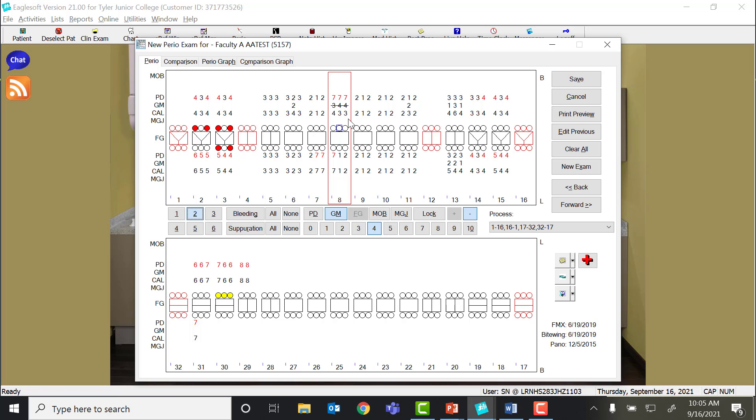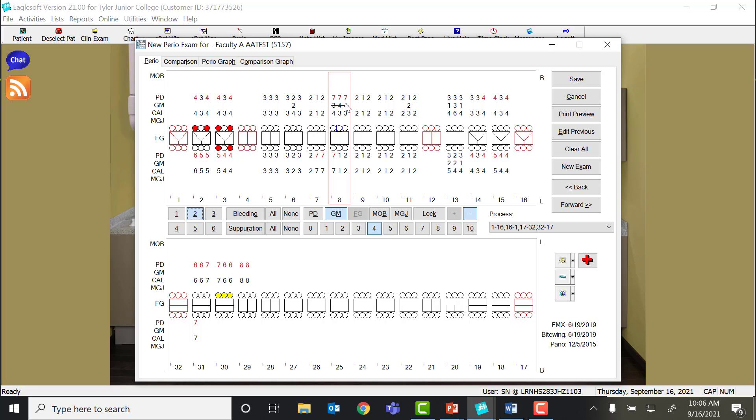You'll notice that it automatically calculated your attachment loss again, because remember that attachment level is equal to CEJ down to epithelial attachment. So I've got my probe depth, but my gingival margin is well above the CEJ. So to get the measurement strictly from CEJ to epithelial attachment, I have to subtract the enlargement. So EagleSoft automatically does that for you. When I'm looking at this probe chart, if the numbers are crossed out, then I know those are negative numbers. And you can see it brought the attachment level to 4-3-3 instead of 7-7-7.